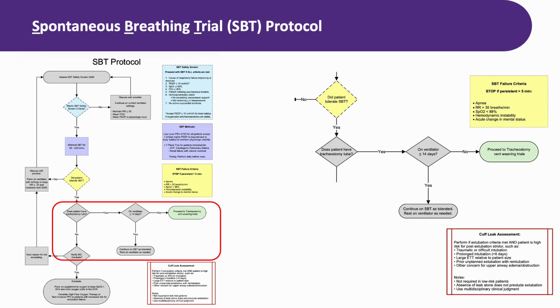Let us wrap up this SBT protocol section with some key points about the overall workflow and how this all fits together in our daily practice. Think about what your morning should look like with these protocol updates. You arrive on shift, review your ventilated patients. For each one, you ask, is this patient a candidate for SBT? You run through the safety screen criteria. If yes, and they're on protocol, you coordinate with nursing and proceed. If off protocol, you communicate with the provider team for an order. If no, you document not indicated and the specific reasons.